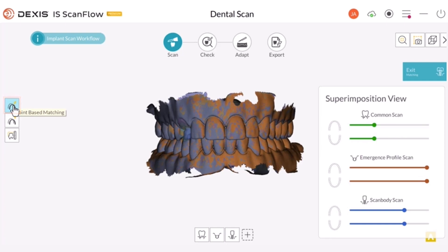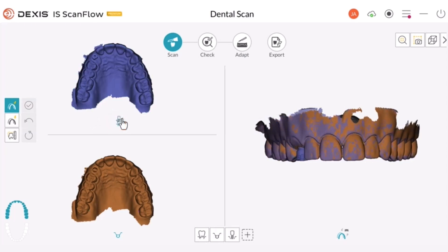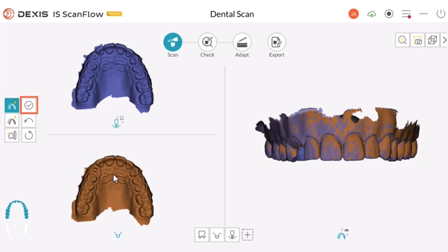Click the point-based matching icon. Point-based matching allows for the adjustment of the implant matching by selecting three matching points on each scan. Click to select three points on each arch, then click the checkmark icon to confirm your selection. Click the implant icon to toggle the scan body. Click to select three points on each arch, then click the checkmark icon to confirm your selections. Click to make any necessary adjustments, then click the checkmark to confirm your changes.